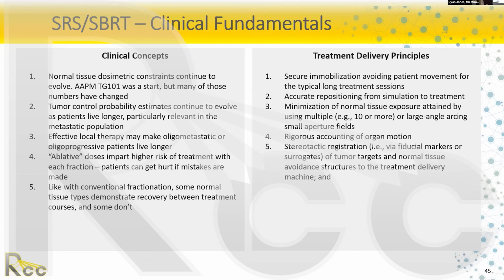Before cone beam CTs were readily available, they relied a lot on rigid markers of coordinates, such as on a frame or fiducial markers. Nowadays, we don't need fiducials for most cases, at least where I'm fortunate. I have access to cone beam CT imaging for my patients. And we use that to essentially achieve the same stereotactic registration. While the original term was meant for some of these coordinate-based systems, we still use that term stereotactic with, you could argue, thousands of coordinates that a cone beam CT supplies.